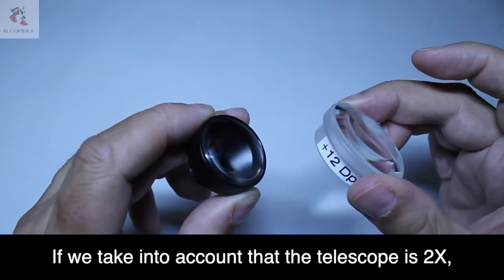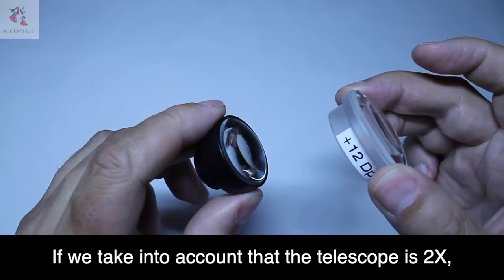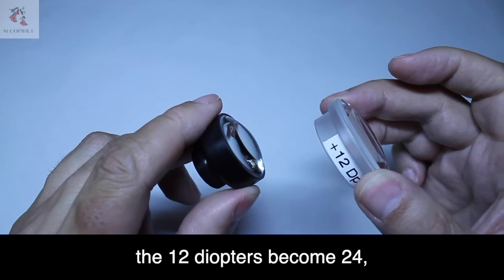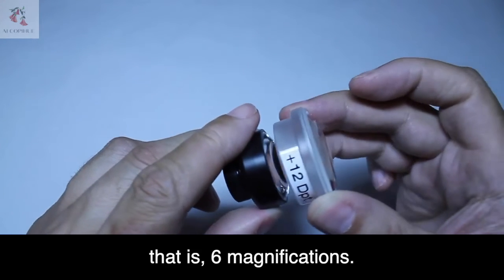If we take into account that the telescope is 2X — that is, it has 2 magnifications — the 12 diopters become 24, that is, 6 magnifications.